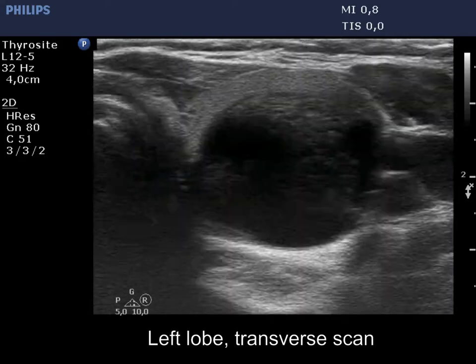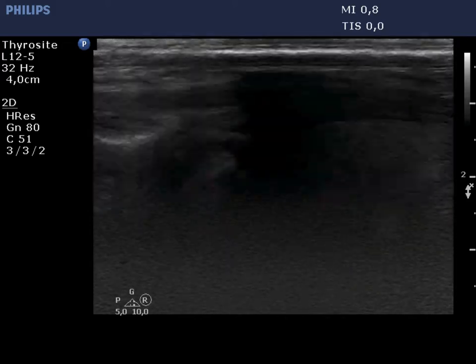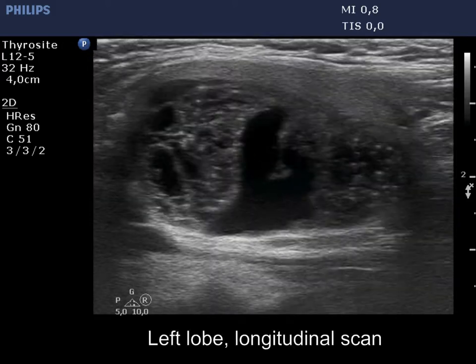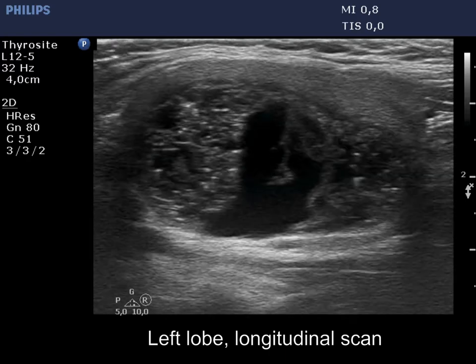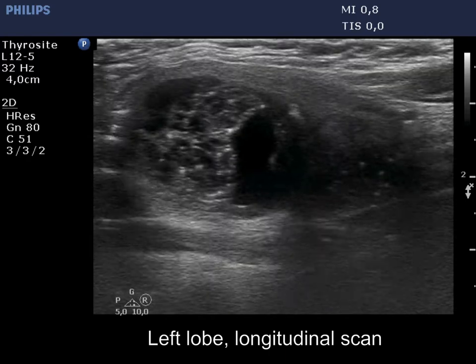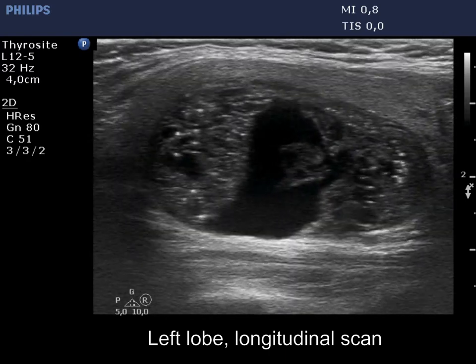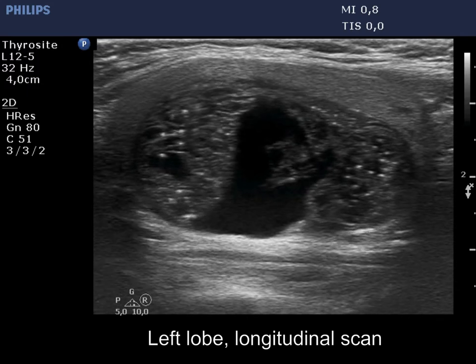The lesion has back wall features with the presence of echogenic lines and granules related to cystic areas. The upper and lower parts of the nodule are composed of spongiform areas, while the middle part is fluid.